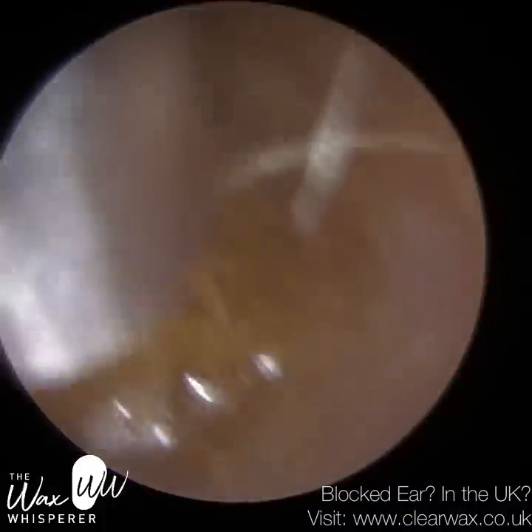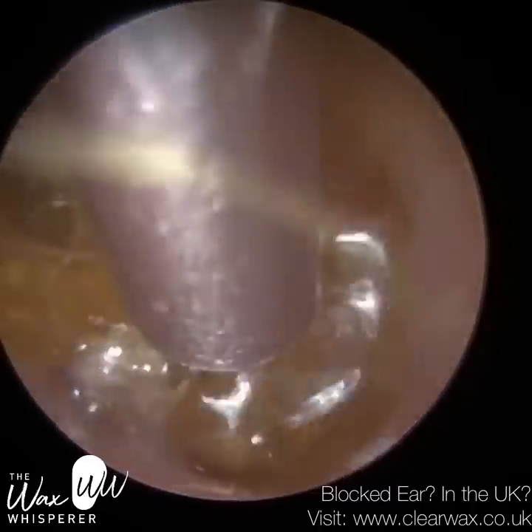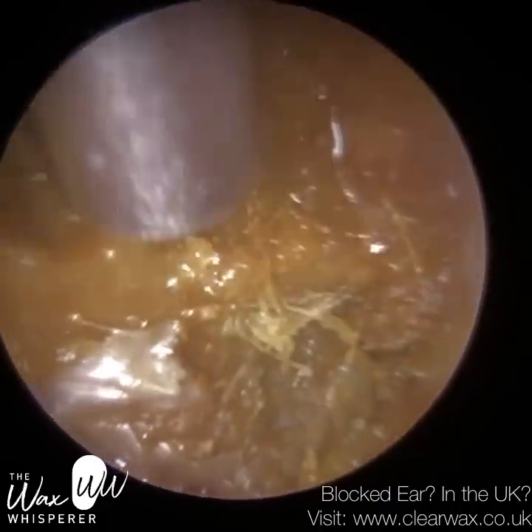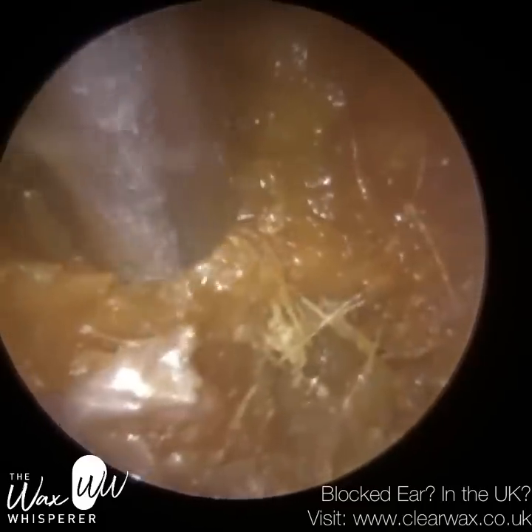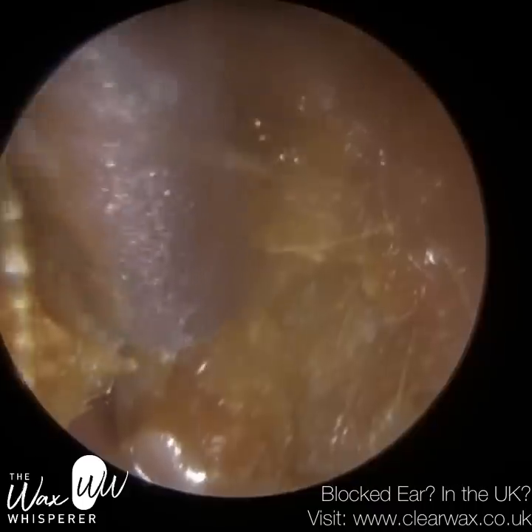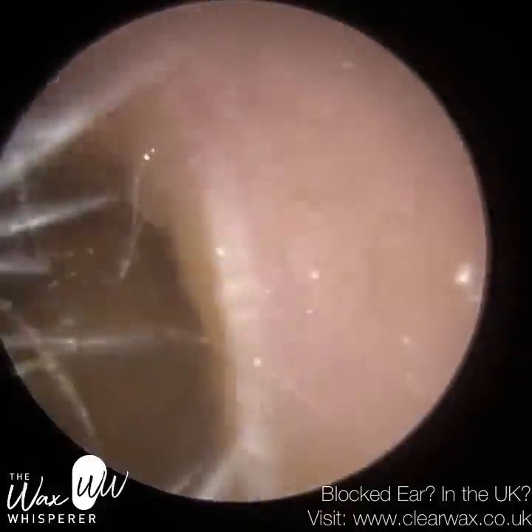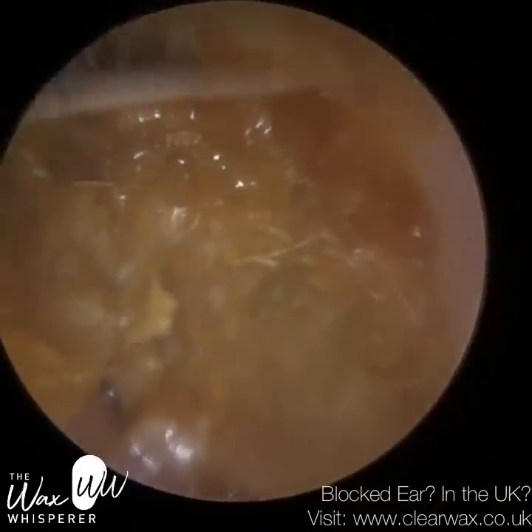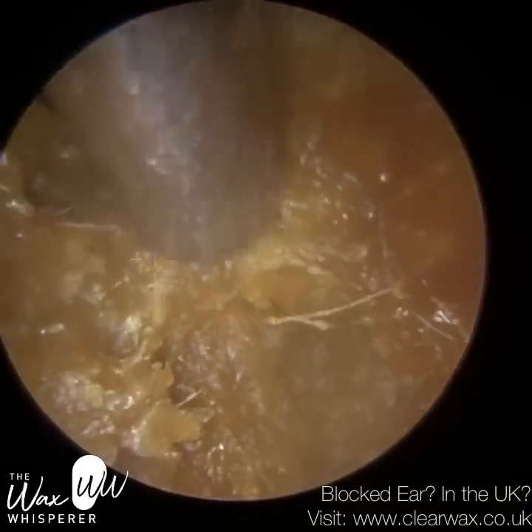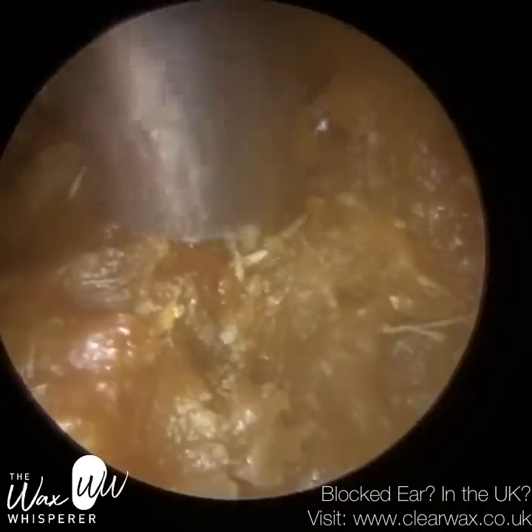I've just put some more oil in and I'm performing the procedure whilst it's in situ. Previously I'd allow the oil to sit for a few minutes then have the patient tilt their head so it drizzles out. But performing the procedure whilst the oil is in situ is far more effective. The slight difficulty is that the oil gets vacuumed up the tube and causes blurring, so I need to come back out, wipe the endoscope lens, and re-enter the ear.